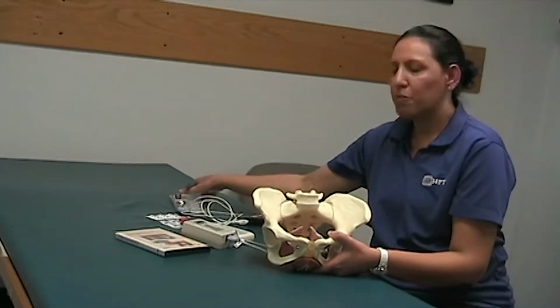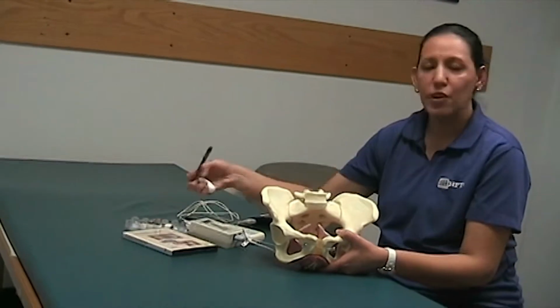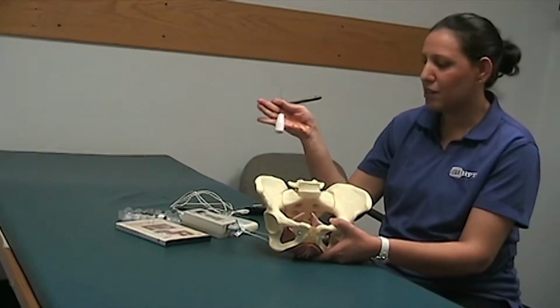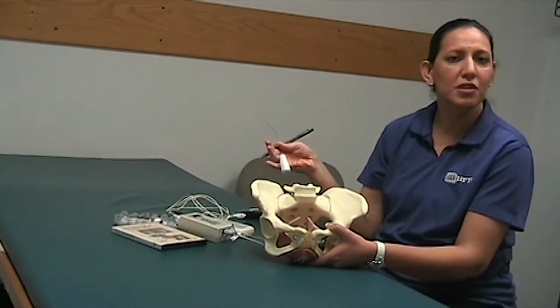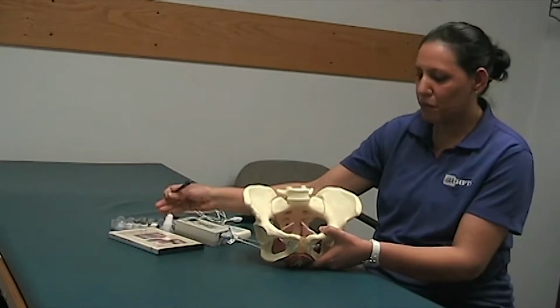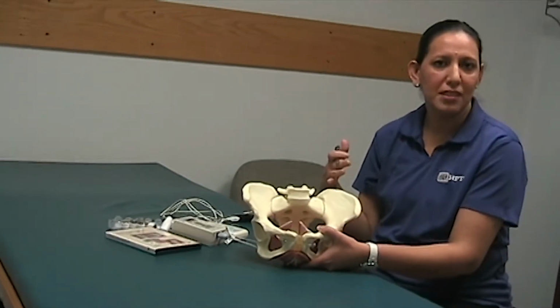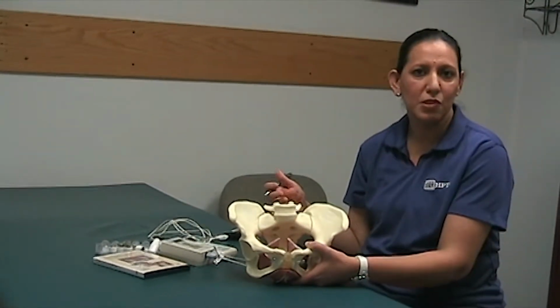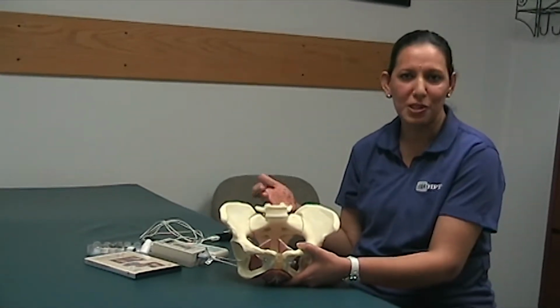And when the patients have progressed about 2, 3, or 4 weeks down the road, then we can also do vaginal weights. And these are weighted cones that they can use internally, and they do different types of exercises with that. So the first step for the exercises is that they would do the exercises lying down, and as they progress, then we progress them to sitting, standing, and functional positions.